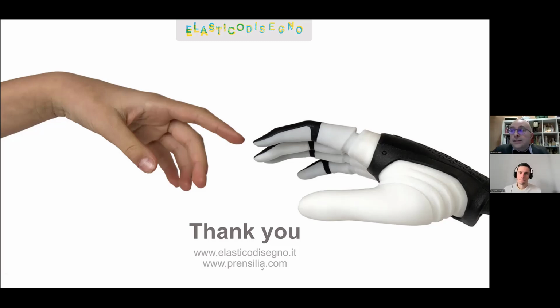Well, that's one of the reasons for the changes that we've done. We've done 3 or 4 iterations so far on the fingers. At first, they were overmolded in the same kind of softer, flexible silicone used for the glove. But then over time, the overmolding was not gripping enough on the 3D printed part. If you stick your nail in where the two materials join, you could just peel it off. And so we've experimented with different hardness of silicone.